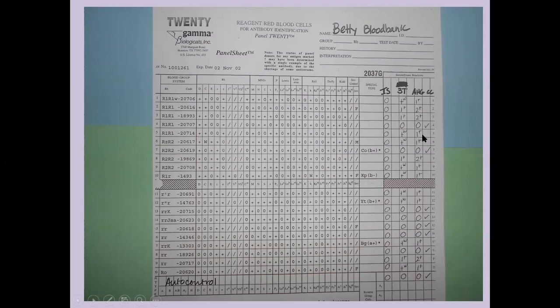This is something that typically happens due to dosage. So if this patient's antibody is reacting with a homozygous cell for the antigen that corresponds to the antibody, we're seeing the stronger reactions versus weaker ones with heterozygous cells. So when you go through, you're going to see that.